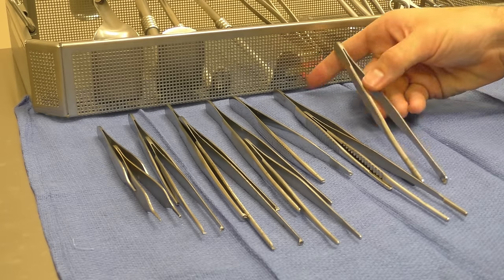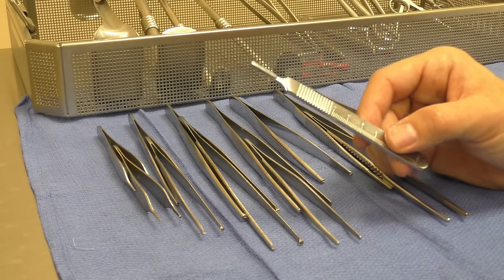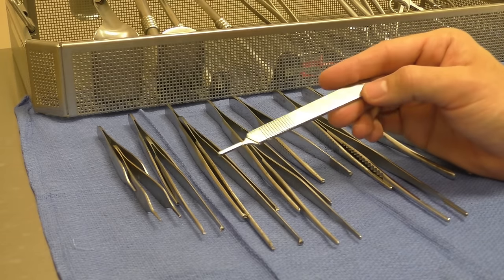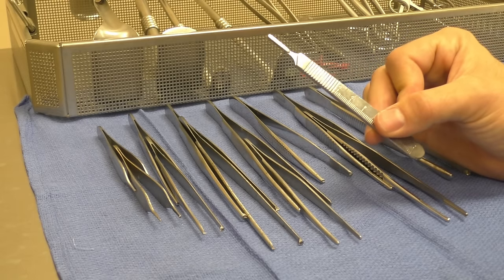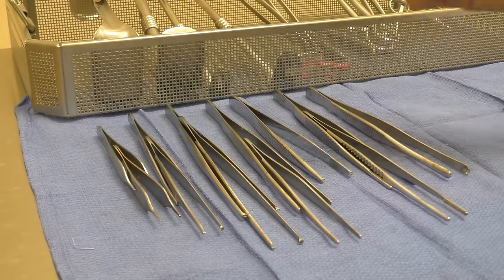Now the last part of this suture bag here is the knife handle. We've just got two number three knife handles. Again, this is like your main knife handle that you're gonna be loading a number 10 blade on for them to use to make the incision. And we just have two of them in this set.